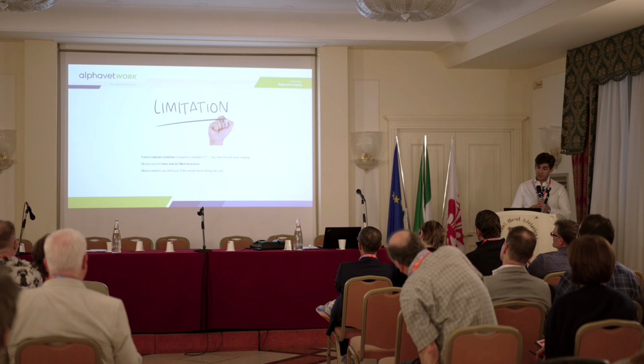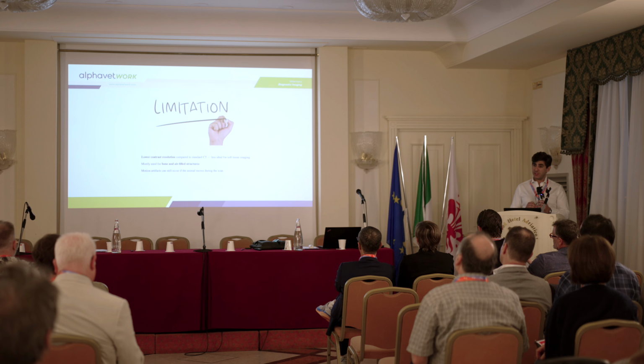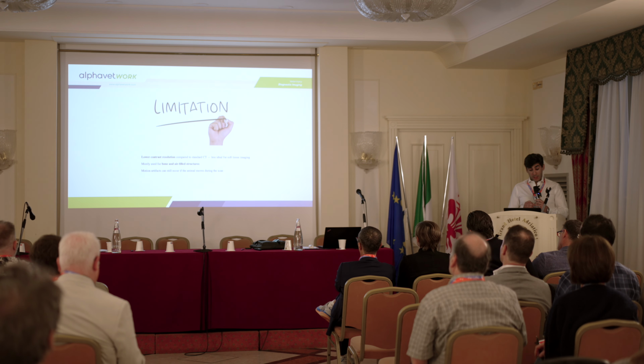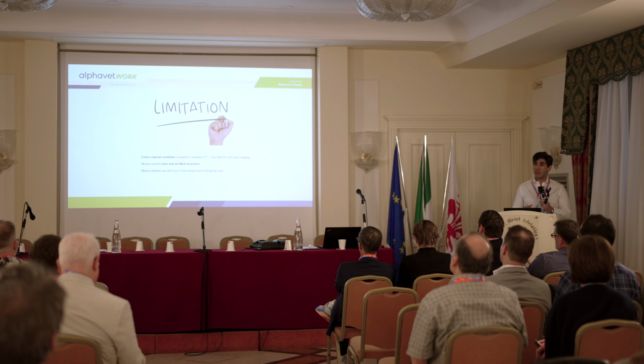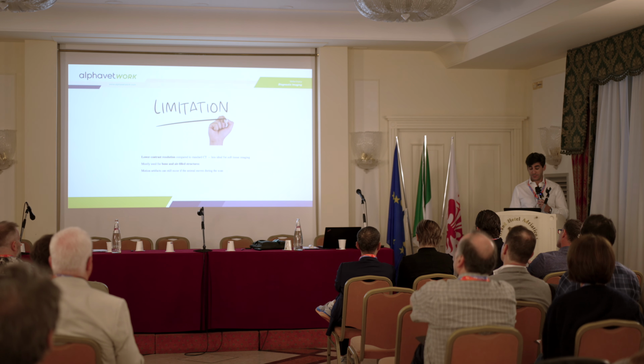What are the limitations? We have a lower contrast resolution compared to standard CT, and I will explain in the next slides in which cone beam CT technology we have lower contrast resolution. We use it mostly for bone and air-filled structures, and we have motion artifacts with breathing animals or cardiac movement. This is something where we are working with the anesthetist, and we'll also have a presentation later.